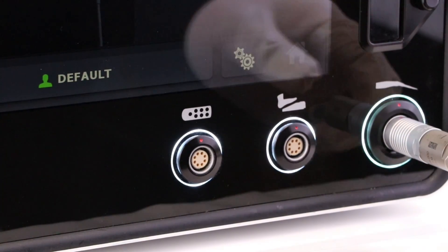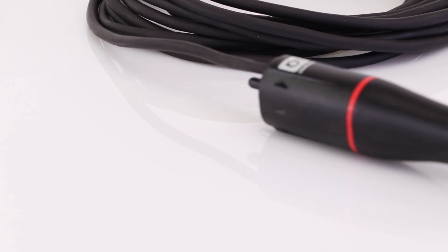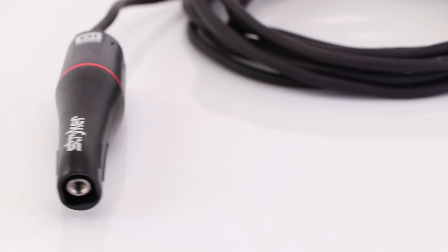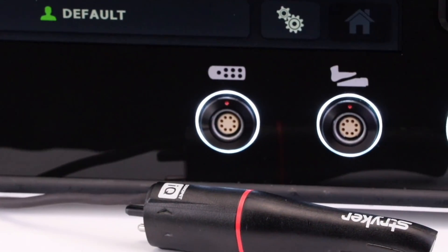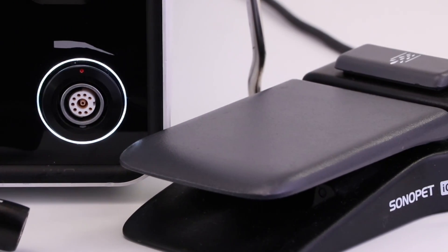Front-facing connections with color-changing feedback and a port light that signals proper setup, one-step connections for irrigation, suction tubing, and sleeve. Irrigation is integrated into the handpiece to improve visibility and control, and all components are labeled or color coded to make setup intuitive and the steps are non-sequential.